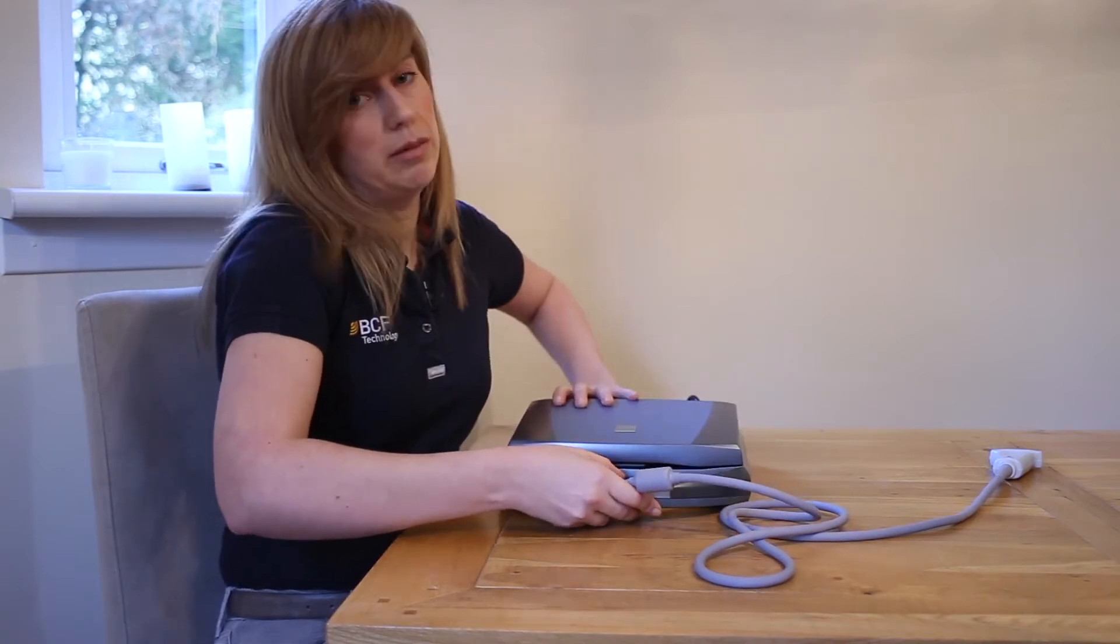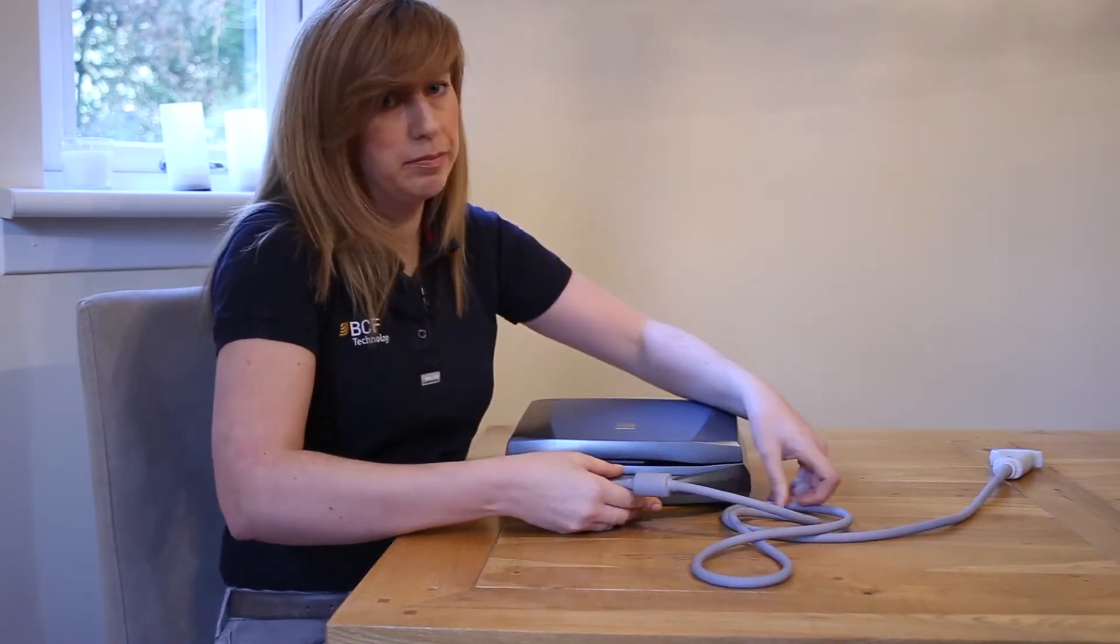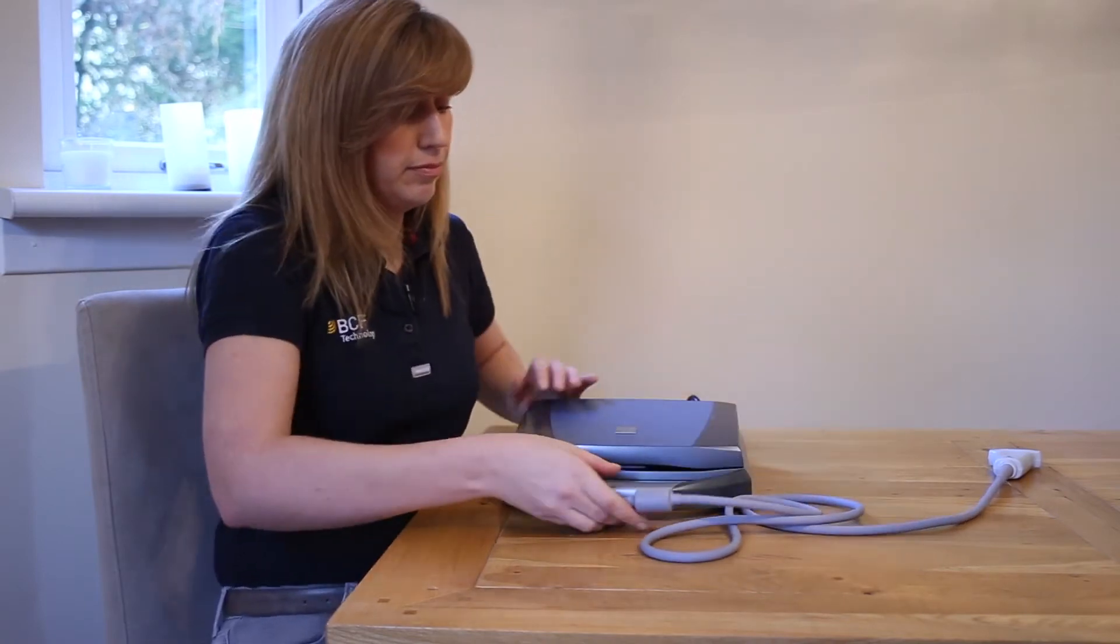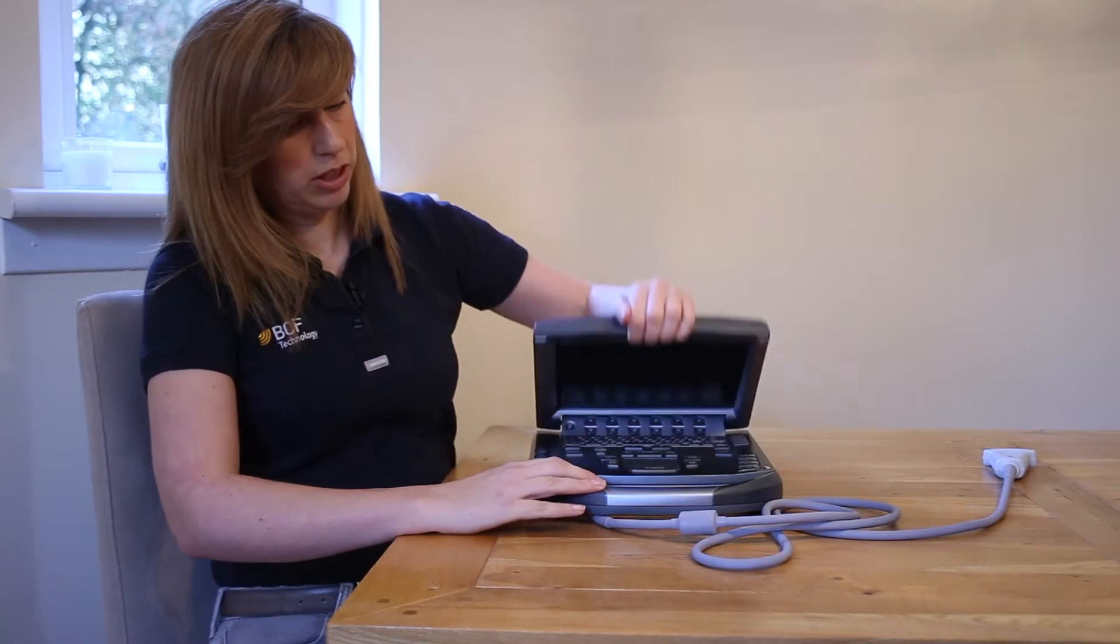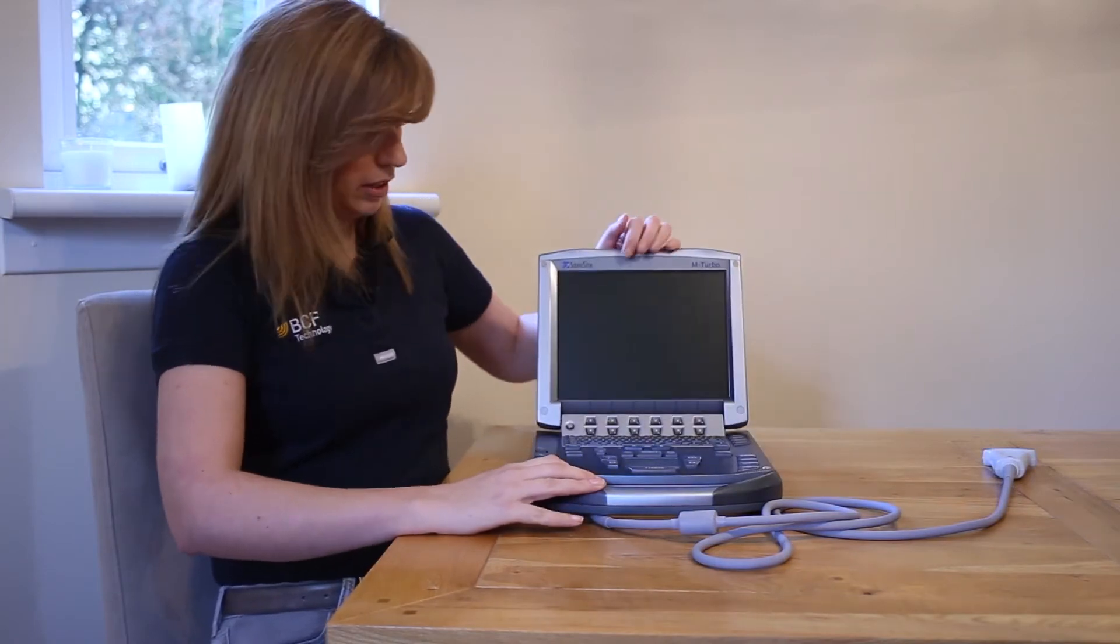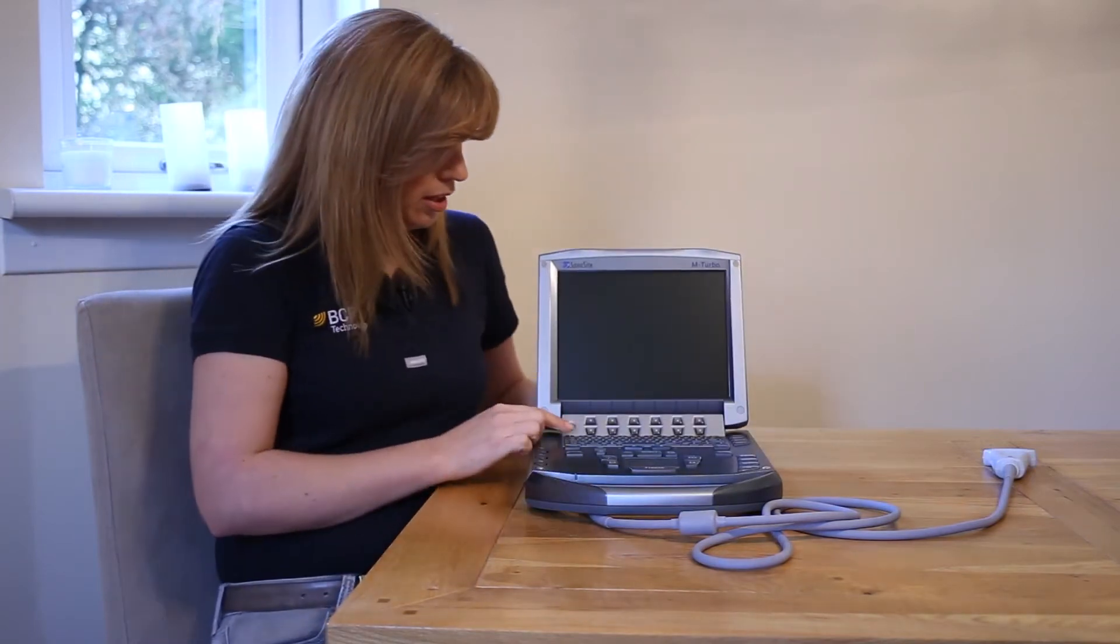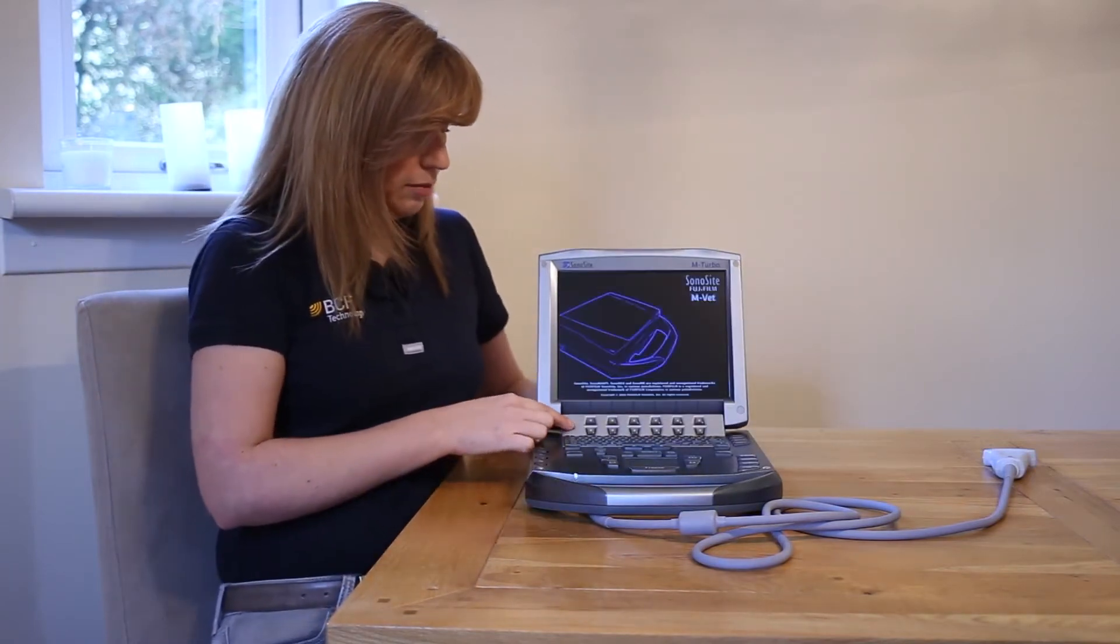To switch on, simply lift up and press the power button at the top left of the keyboard.